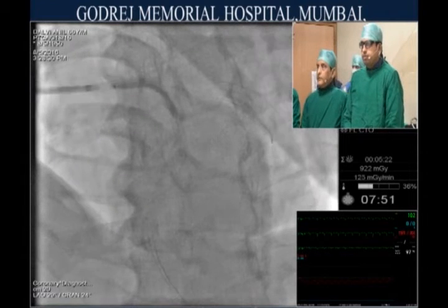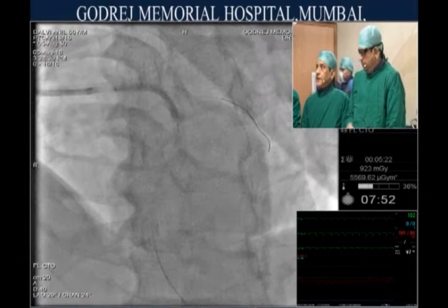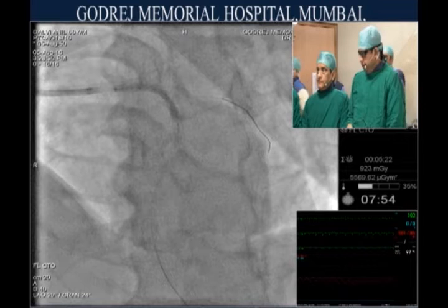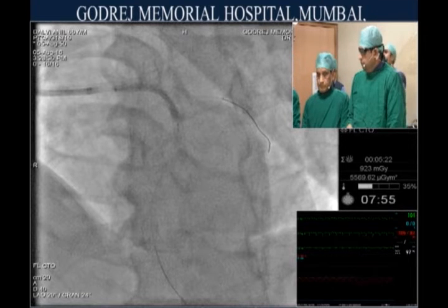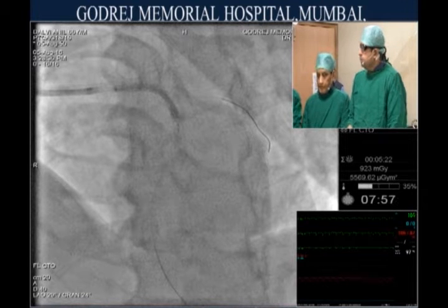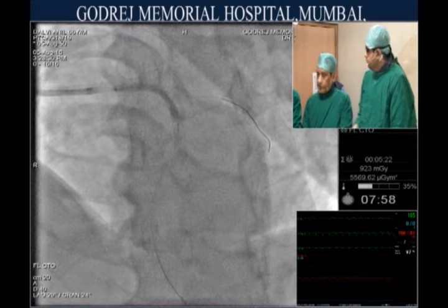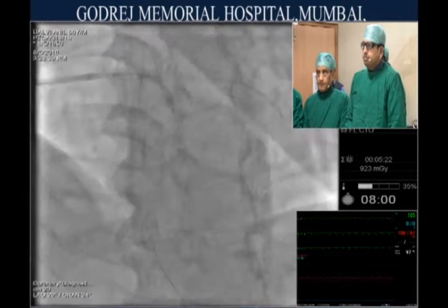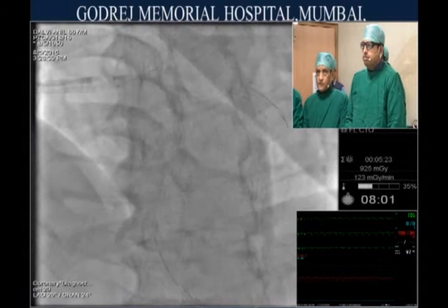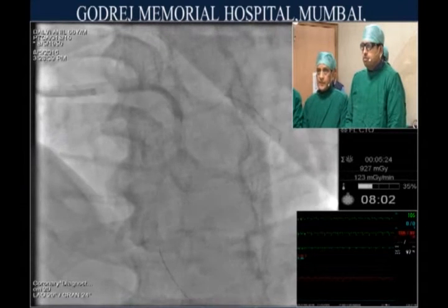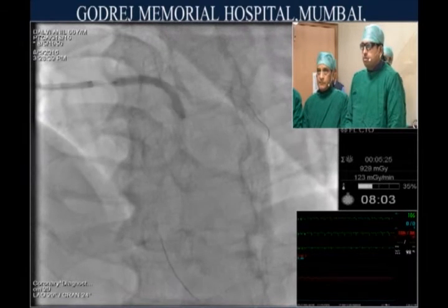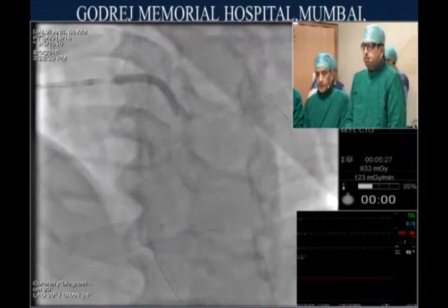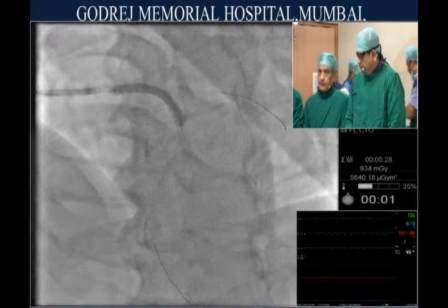Saturation is 97 percent. We go up quickly again to 14 atmospheres: 6, 8, 10, 12, 14 — negative.